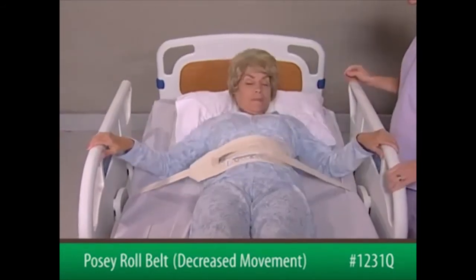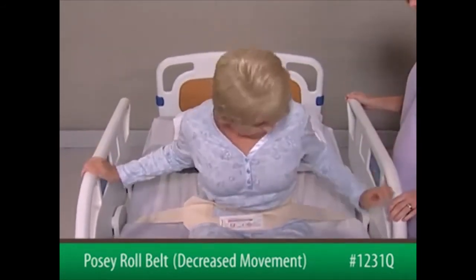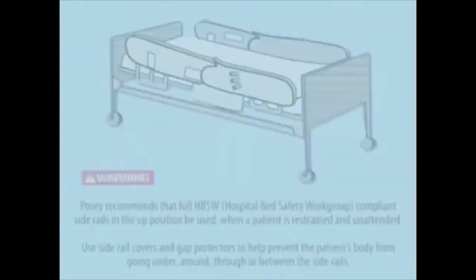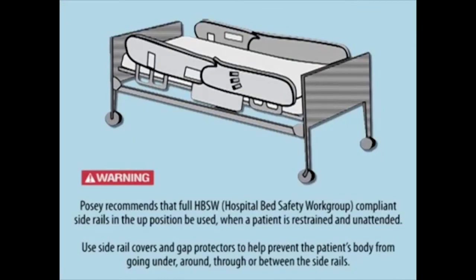After the belt application, the patient will be able to sit up but not roll side to side. Posey recommends that full HBSW compliant side rails in the up position be used when a patient is restrained and unattended.